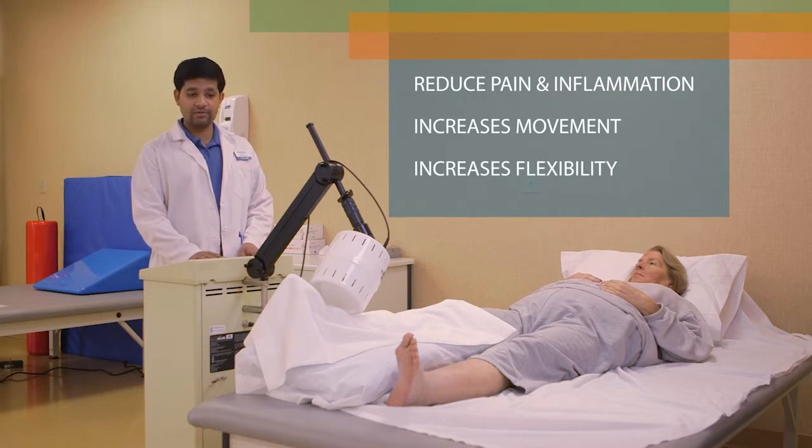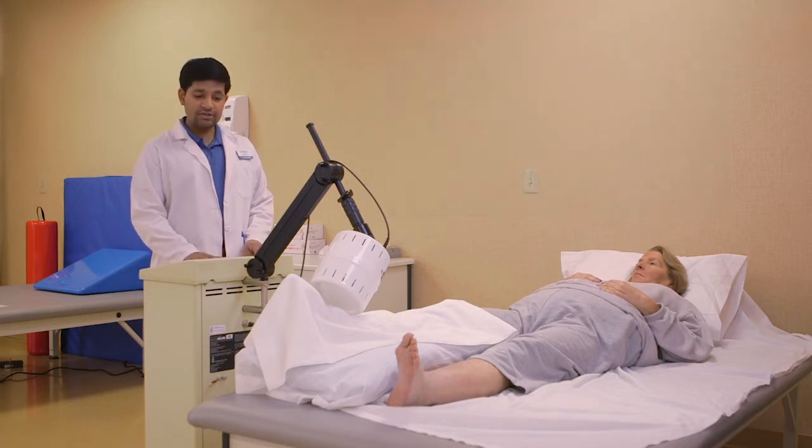Mary came to us with a lot of lower extremity weakness and swelling in her feet. So I'm using this modality to reduce the edema so she can walk freely, and it helps in getting her up and going faster.